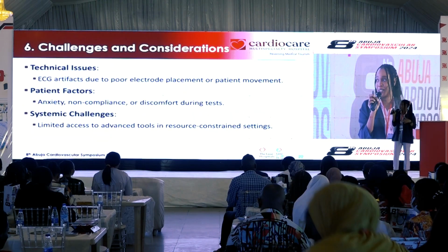See my chest. So it's just trying to make them comfortable and relaxed, so that you'll be able to get effective results in your test.